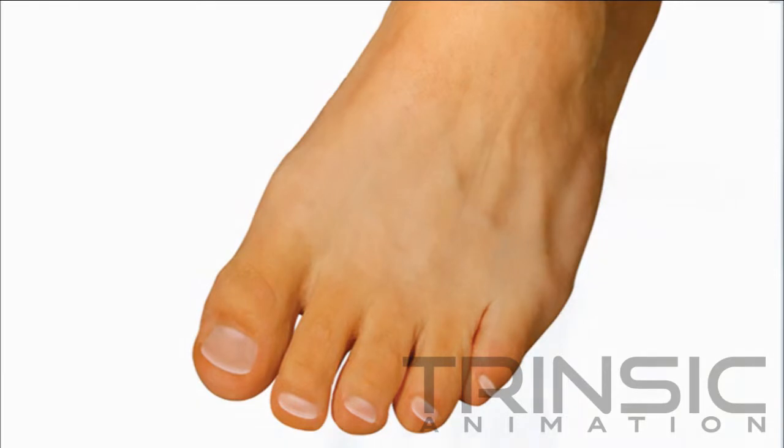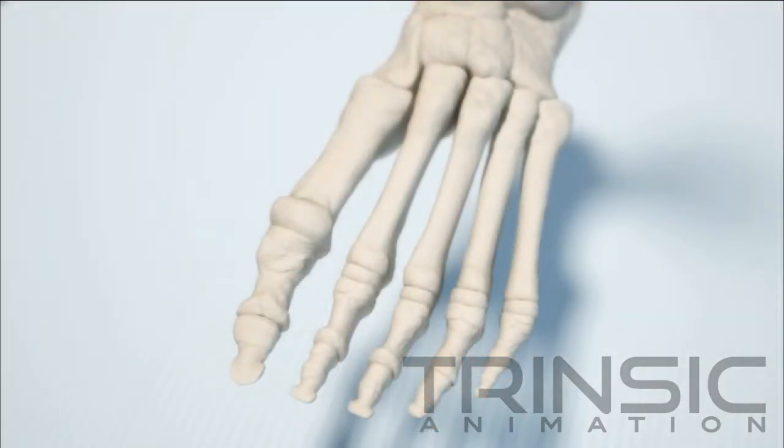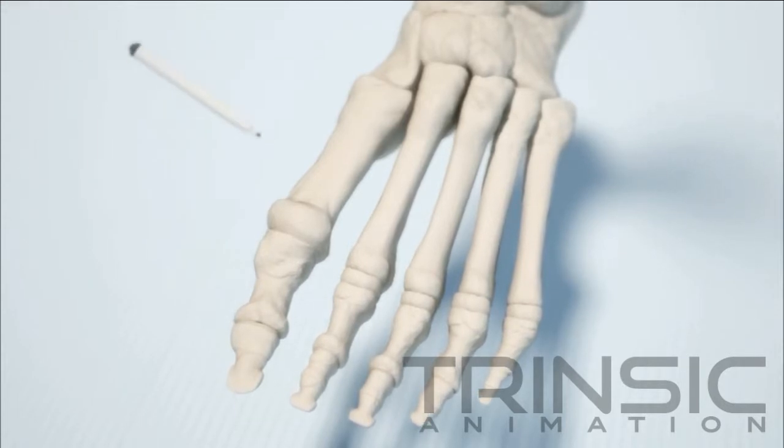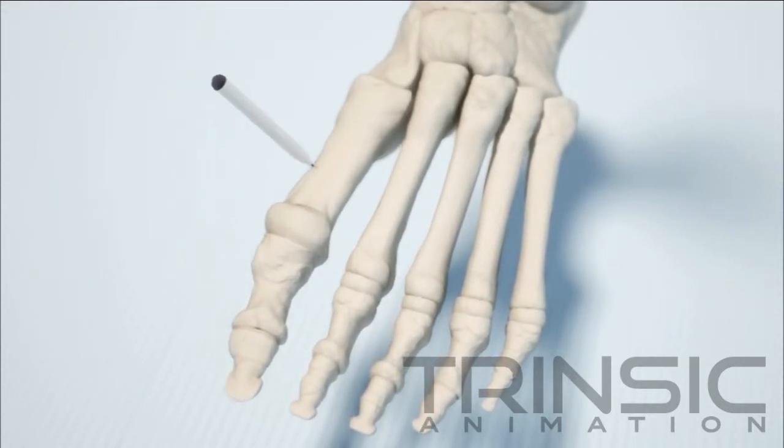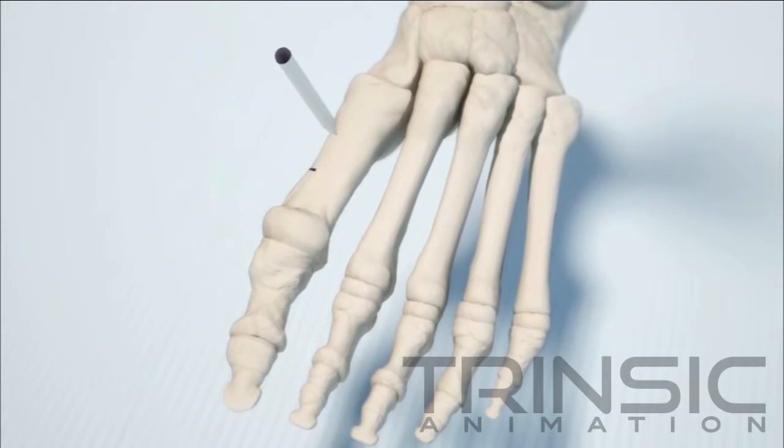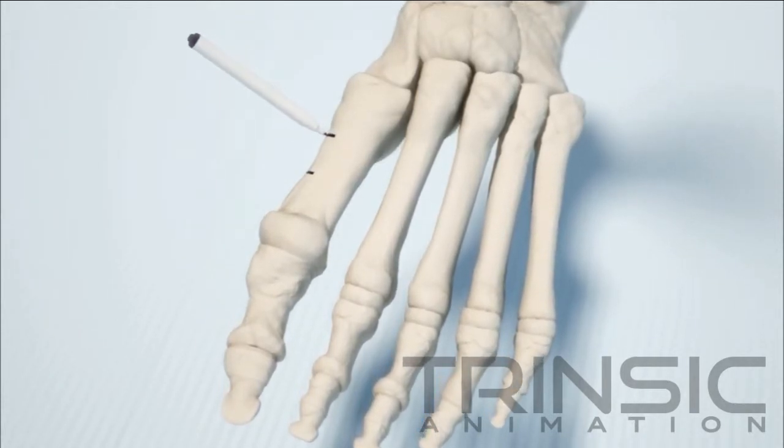It is advisable to insert the half-pins before making the osteotomy. With a surgical pen, mark the desired location for the two half-pins, one on each side of the proposed osteotomy. The pins should be about 25 mm apart.